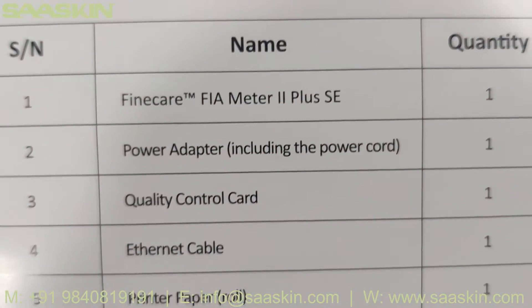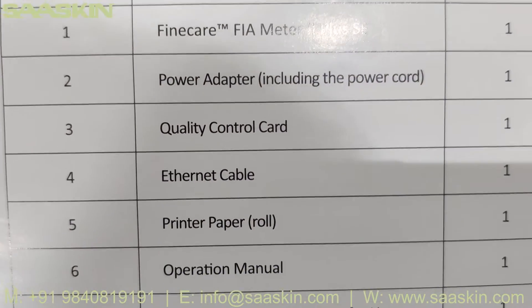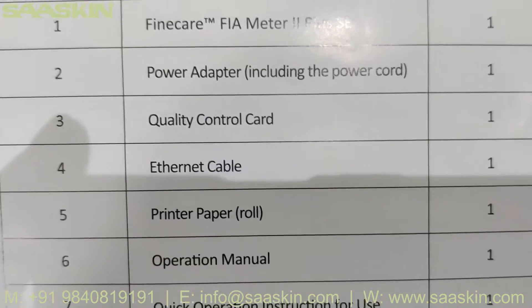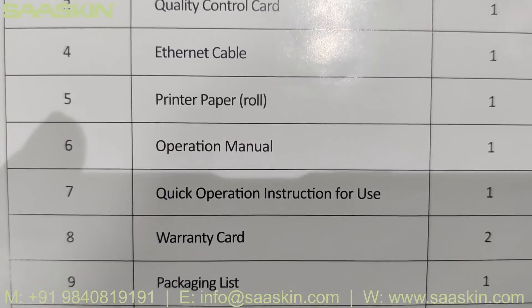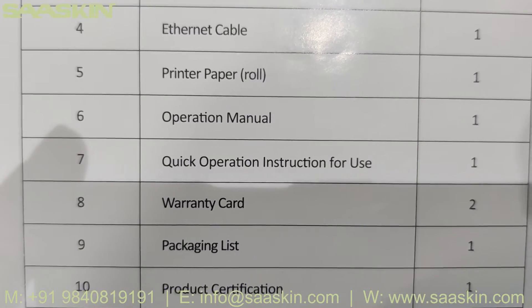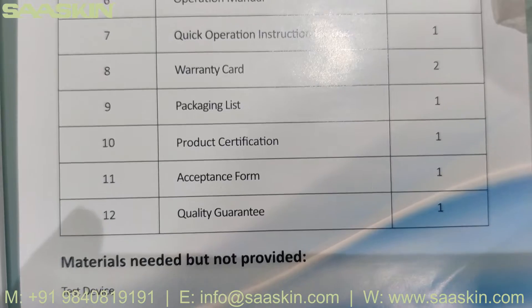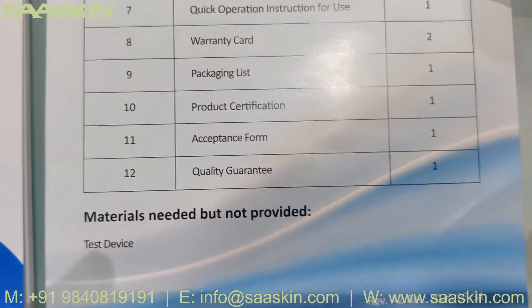The FineCare FIA Meter 2 Plus SE packaging list includes: power adapter including the power cord, quality control card, Ethernet cable, printer paper roll, operation manual, quick operation instruction for use, warranty card, packaging list, product certification, acceptance form, and quality guarantee.